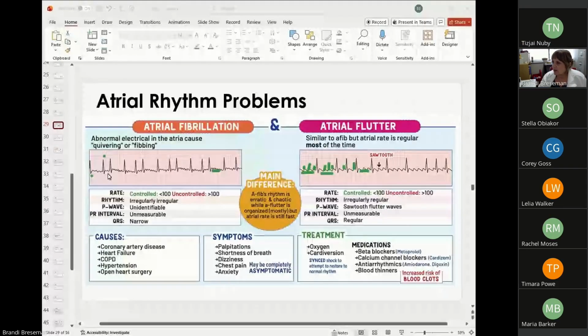So we shock the actual patient, but we shock them with a lower amount of electricity and we shock them on a specific part of the rhythm. Remember when I was talking about pacing somebody and how you put your defibrillator in synced mode and you get that little dot on top of each QRS that lets you know your machine is synced to your patient's specific rhythm.